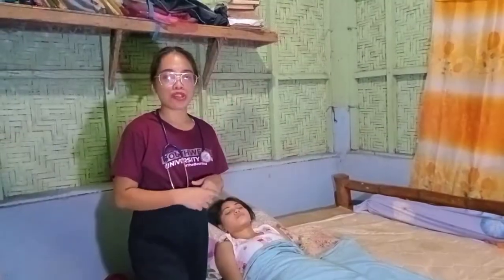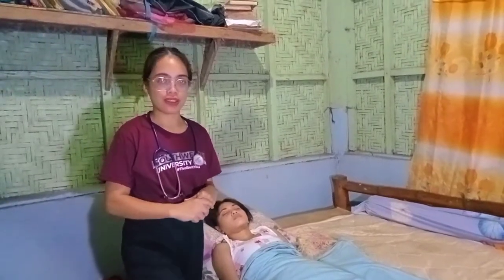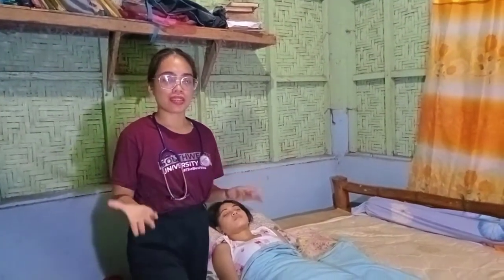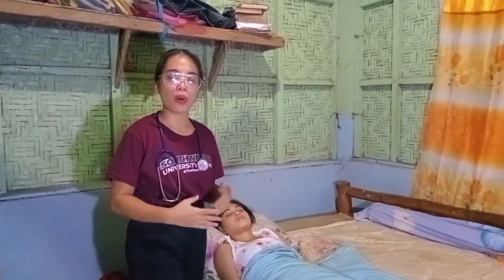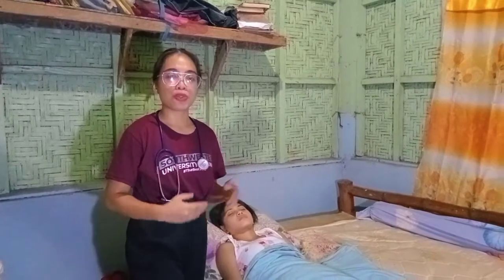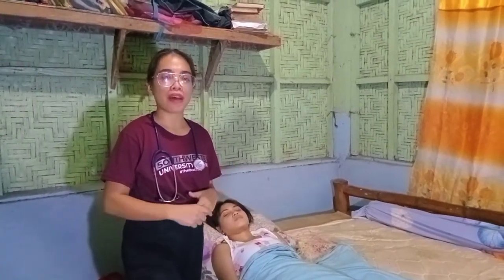Feel the amplitude for strength and thrills. The next thing that we should do is to auscultate the carotid arteries using the bell of the stethoscope. Listen for a bruit. A bruit is a blowing or swishing sound that is produced by turbulent blood flow from a narrow vessel, which is indicative of occlusive arterial disease.